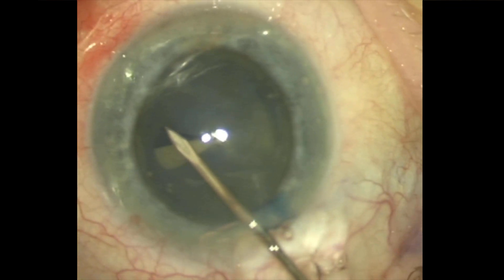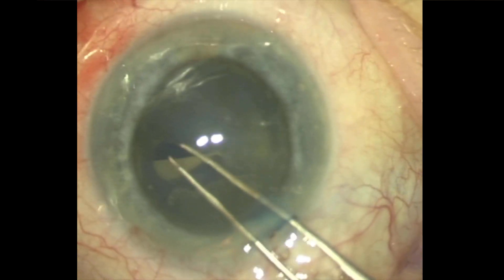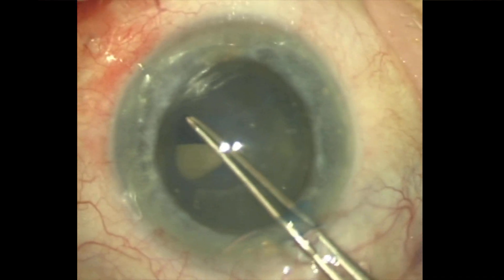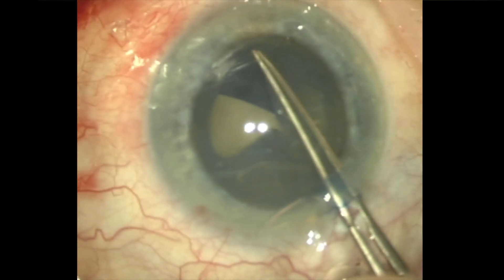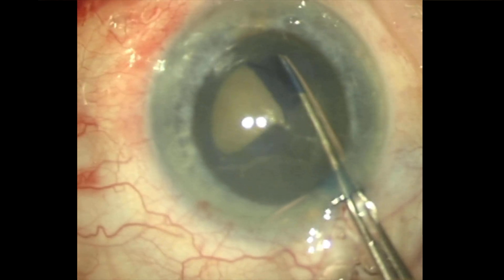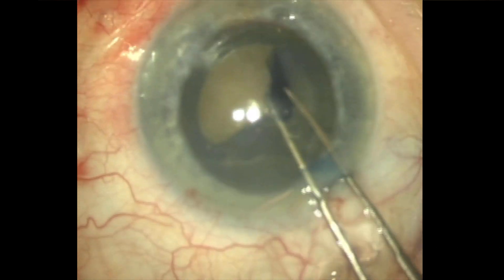We tend to use vision blue dye for much denser cataracts where there's a poor red reflex. Hopefully with the capsule stained blue you're able to appreciate the way that I'm performing the capsulorhexis.